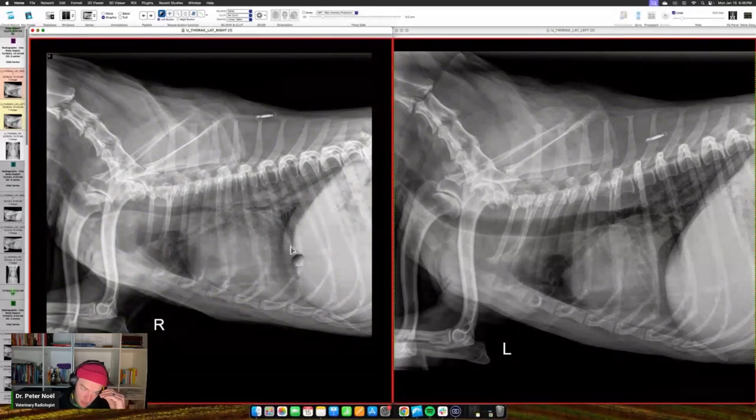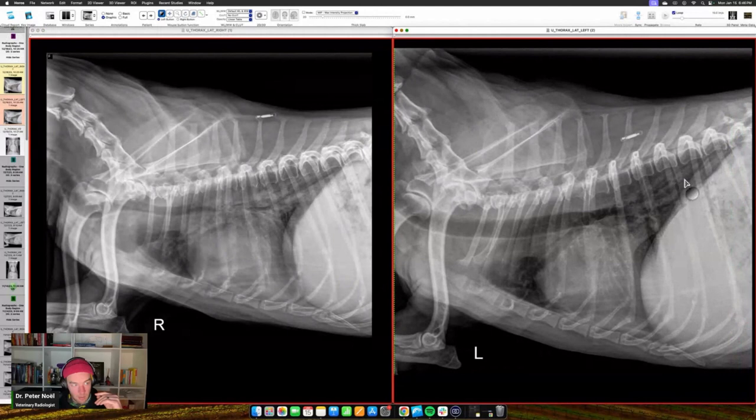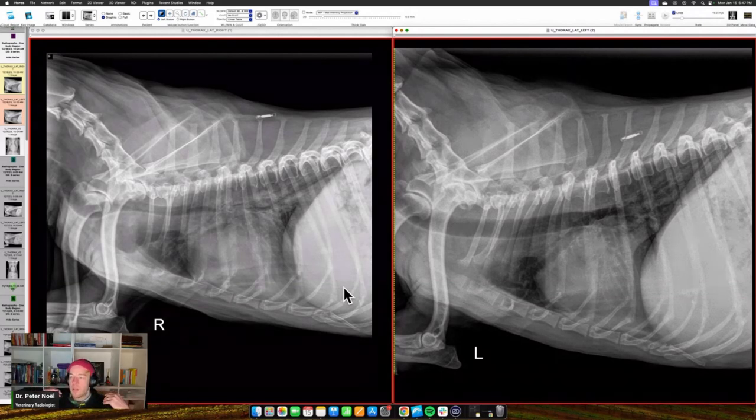He's got edema, there's a lung pattern. And then over here, you think maybe there's still a lung pattern, but it's less. So when you inspire, you bring in the black gas. When you bring in the black gas, you contrast that with the whiteness of the pulmonary parenchyma, the interstitium, the blood vessels, the airways, the normal things. And you also contrast that with the abnormal things like nodules, masses, and edema, okay? And so you want as much blackness in those lungs as you can get.